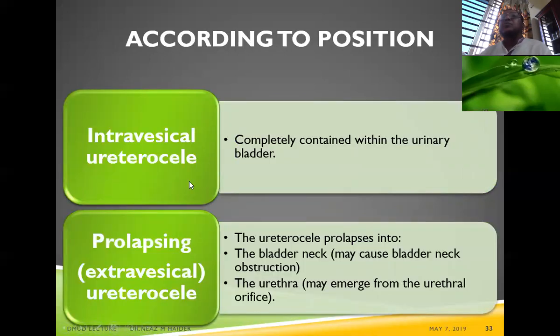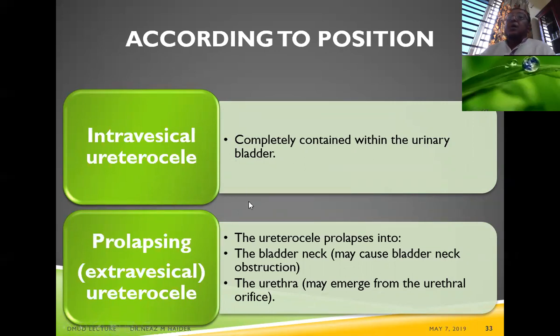An intravesical ureterocele is completely contained within the urinary bladder — this is the variety most commonly found but often missed. A prolapsing ureterocele is extravesical; the ureterocele prolapsed into the bladder neck, may cause bladder neck obstruction, and the ureterocele may emerge from the urethral orifice.